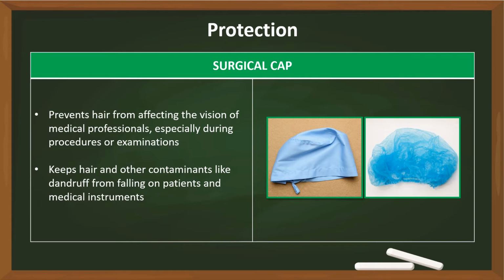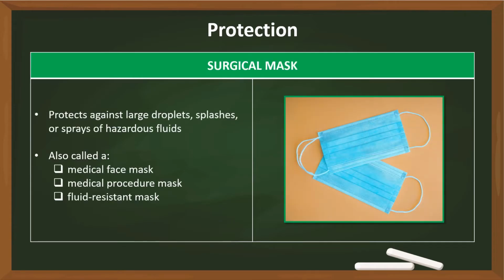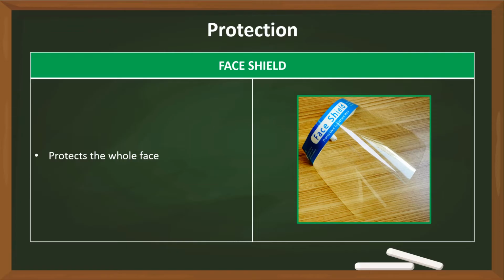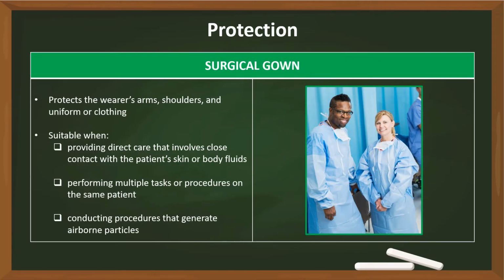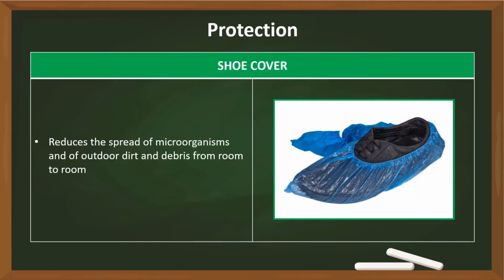Surgical cap, goggles, surgical mask, respirator, face shield, medical apron, surgical gown, surgical gloves, shoe cover.